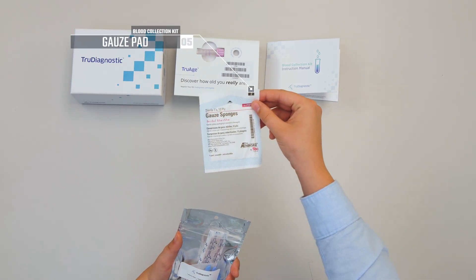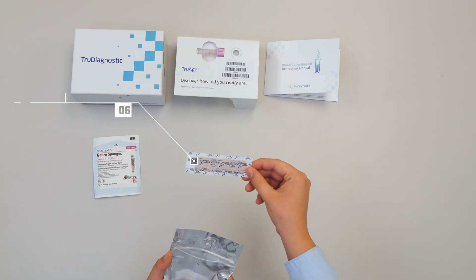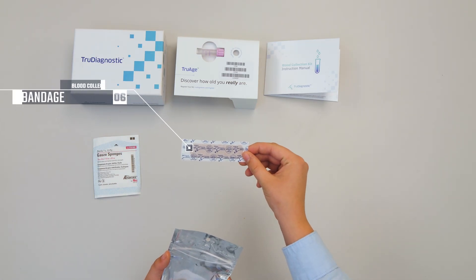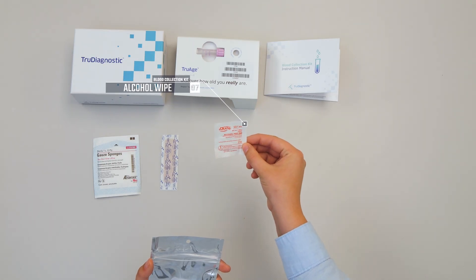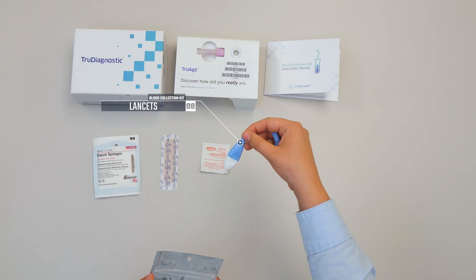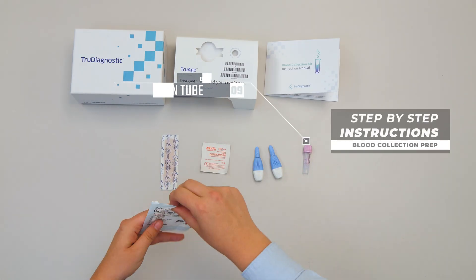Your kit includes the following items: a gauze pad, a bandage, an alcohol wipe, and lancets. A spare lancet is provided if you are initially unable to fill the collection tube. Also included is a blood collection tube.